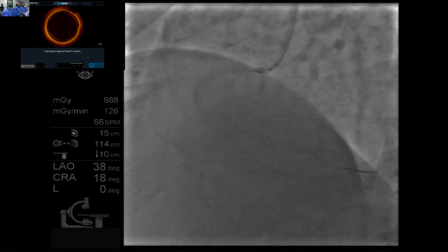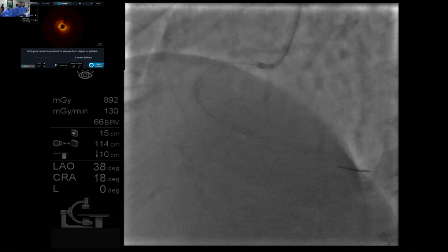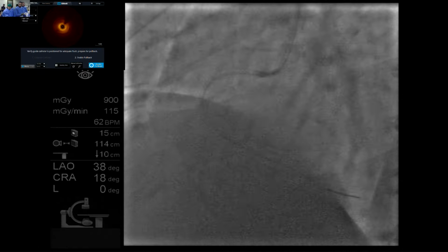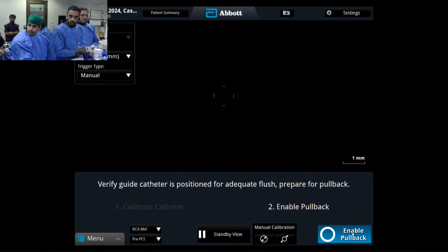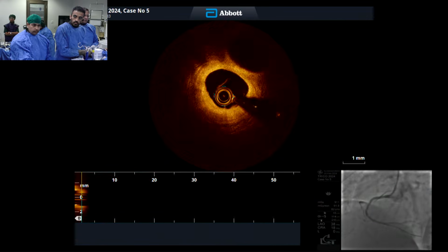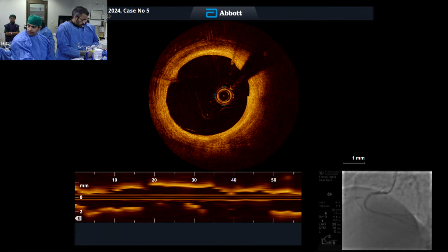You see the lens moving, Aman, and then inject very fast. Start injecting slowly. First fill it up slowly. Ready? Go in, push, push, now. Push, push, push, inject. Push, push, push, push, push. Super. Nice picture.